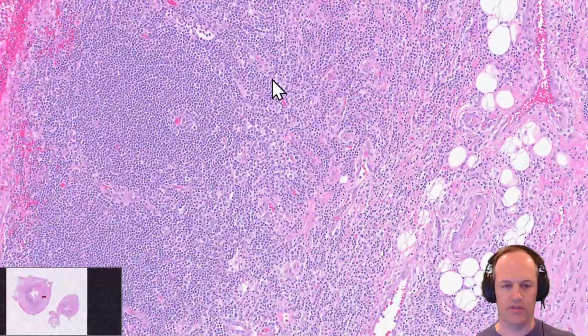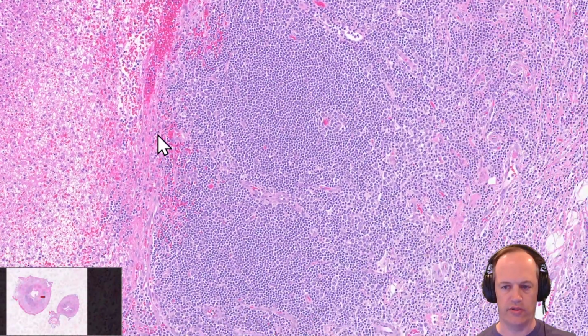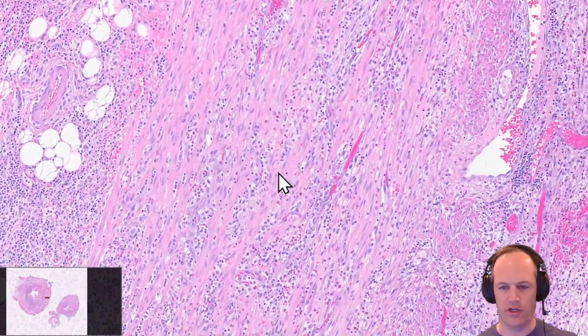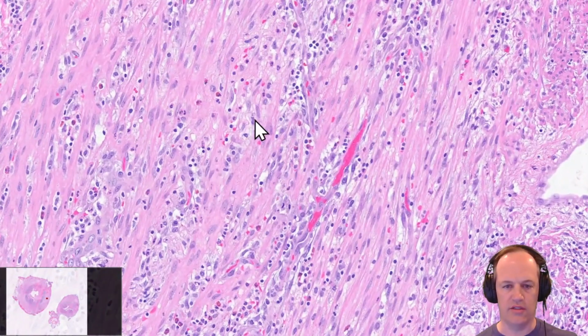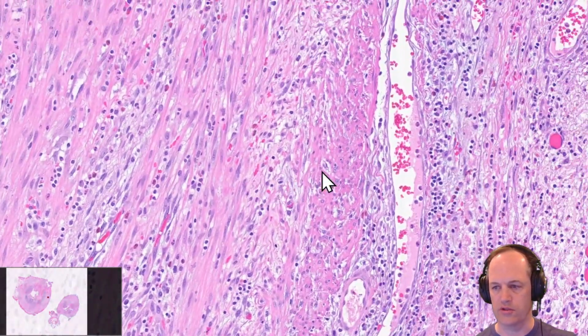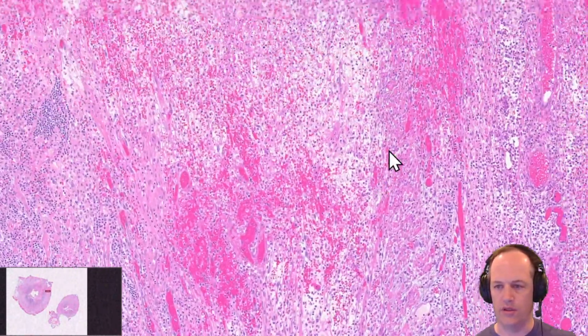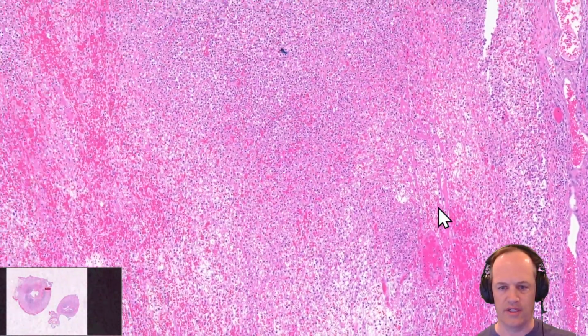of it microscopically. So here's another appendicitis where we see acute inflammation and histiocytes replacing the mucosa, and we have neutrophils that are getting all the way through the wall. You can see there's even eosinophils here. Sometimes eosinophils are precursors of neutrophils, neutrophils declaring themselves in appendicitis. But look what happens here.